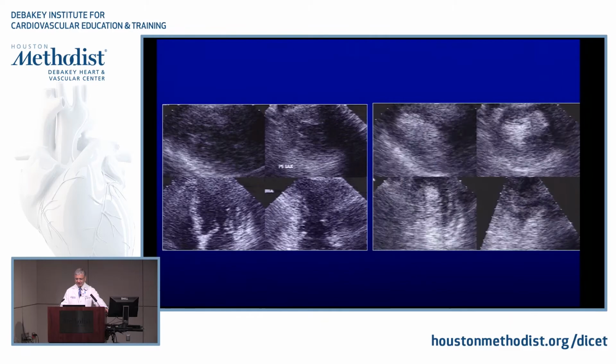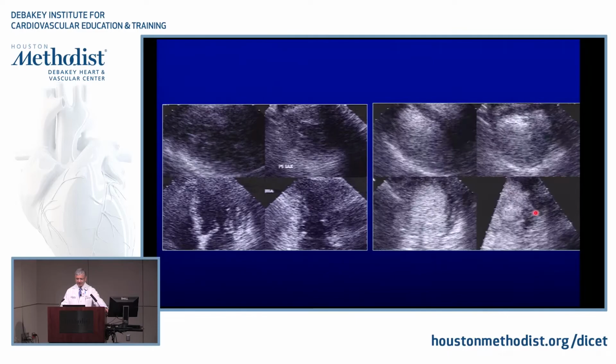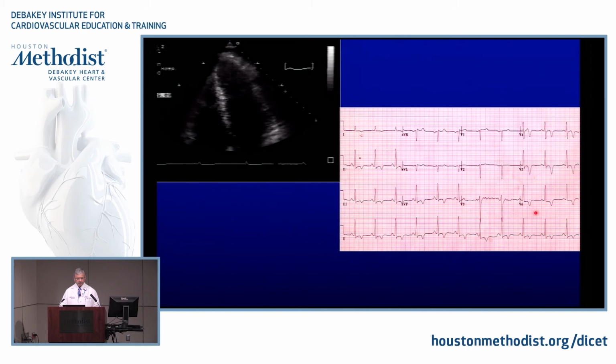And it is in an area where your eye kind of draws the conclusion without you seeing it. And this is your two-chamber view. It was actually a true aneurysm in a very unusual situation, not a pseudoaneurysm. Okay? This one we did live. It was a live case in Washington, D.C. Patient came in the night before with chest pain, and that's what you see on the EKG. And this is the echocardiogram. So the live audience was there.